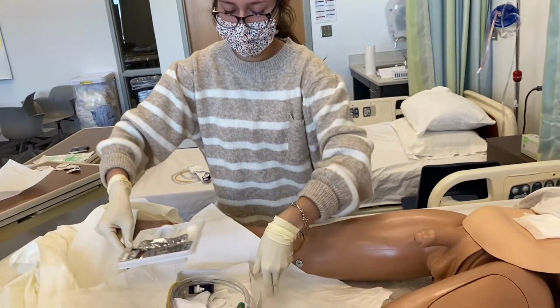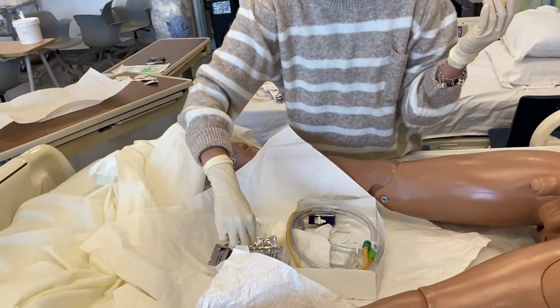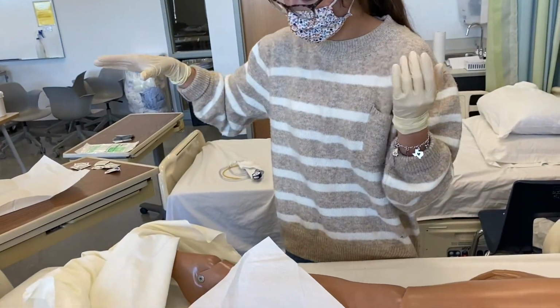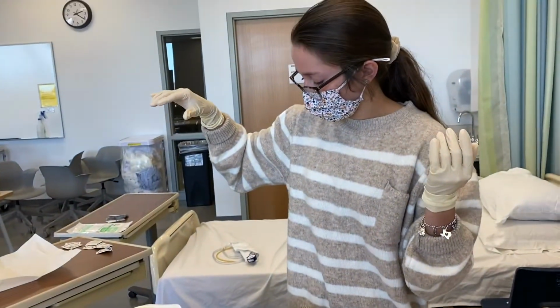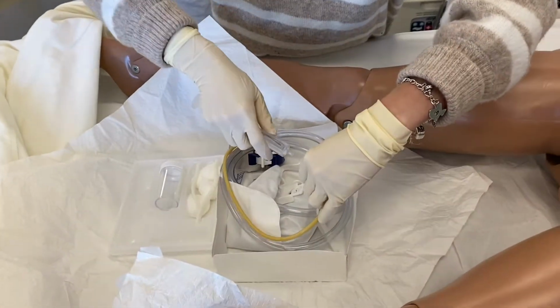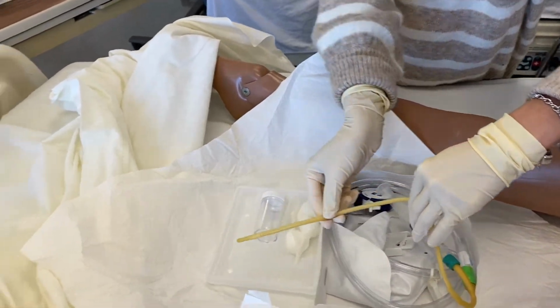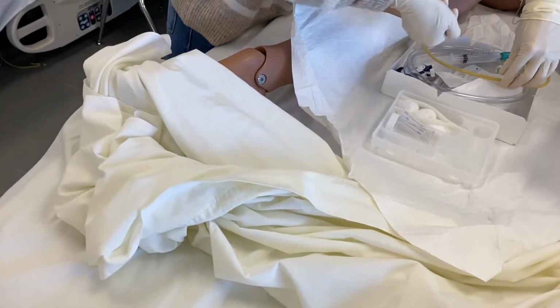I'm going to take this and like that. Okay. So first I am going to remove my betadine. I'm going to put it over the cotton balls. Discard. I'm going to get the lubricant and put it in here. Discard. I am then going to get my syringe and hook it up to my catheter. I'm going to take the top piece of my catheter and put it in the lubricant. And then I'm going to place it back in here. Okay.